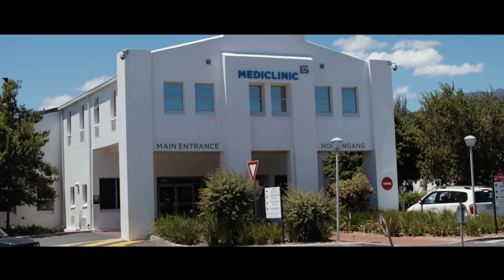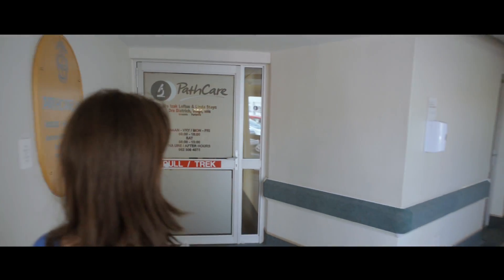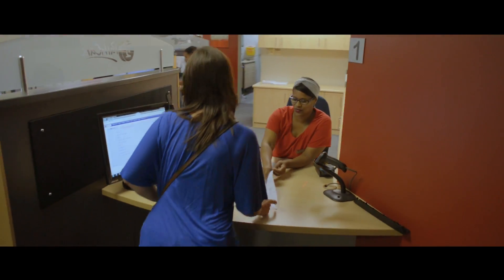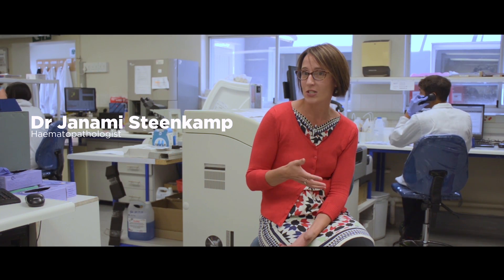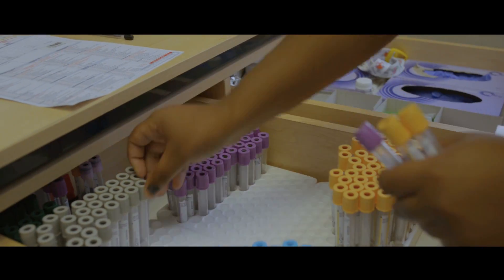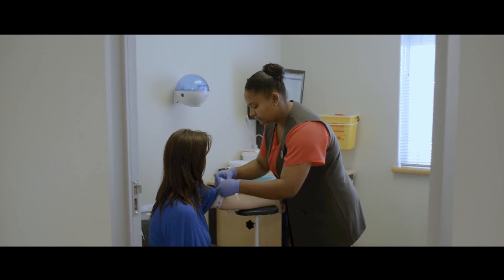Blood tests may be ordered for various purposes. It may be that you're an outpatient visiting your GP or a physician, or it may be that you are an in-hospital patient where certain bloods need to be done as a pre-operative procedure or to assess the severity of your condition.